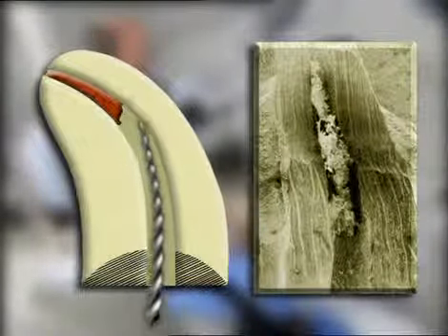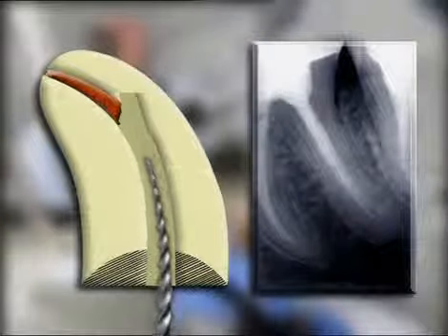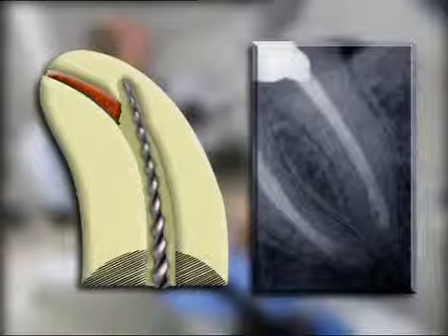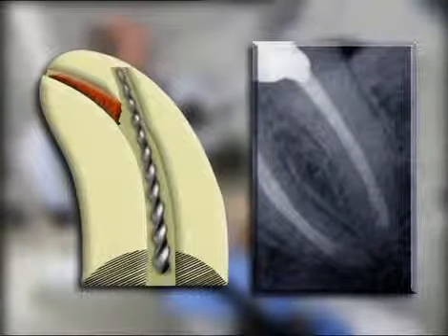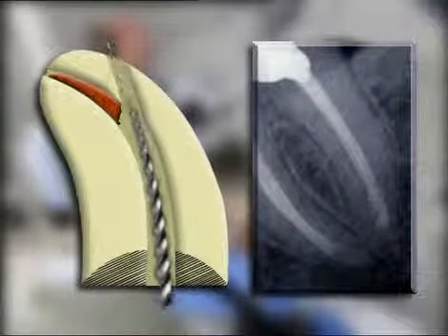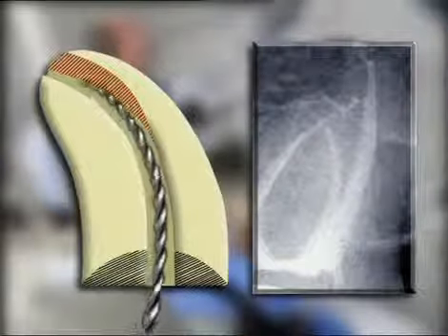An internal transportation occurs when the foramen becomes clogged with dentin mud or denticles. Clinically, it is characterized by the loss of working length or leads to a new false path. External transportation means the tearing of the apical foramen or a direct perforation. The foramen should be kept as small as practical.